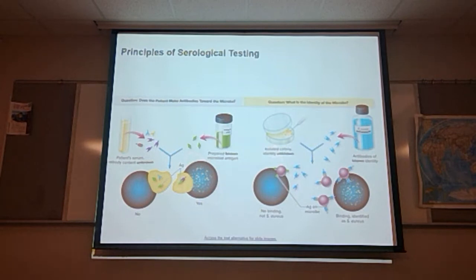Same thing over here. You get the bacteria from a growing colony. You put in the antiserum for Staph aureus. If you get a reaction, that means the bacteria growing is Staph aureus. If you do not get the reaction, then it is not Staph aureus.